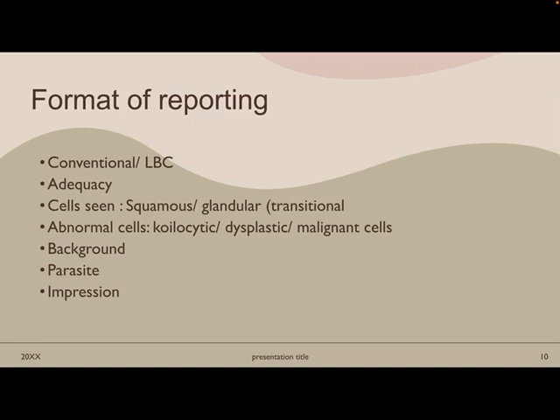And then the impression. You should know the Bethesda criteria to write whether it is negative for intraepithelial lesion or malignancy, or you put it under LSIL, HSIL, or especially an atrophic smear also, you should know how it looks. And I would say in pap also you can put a DD, because the case which I got in the exam was HSIL or atrophic smear kind of.